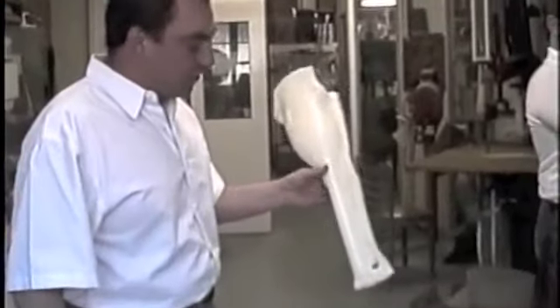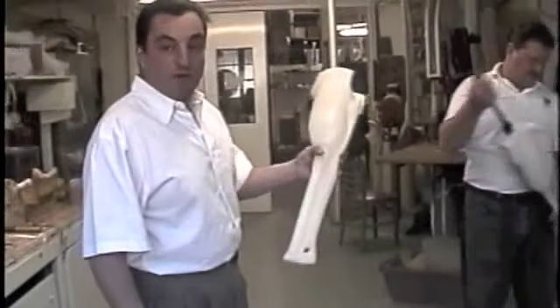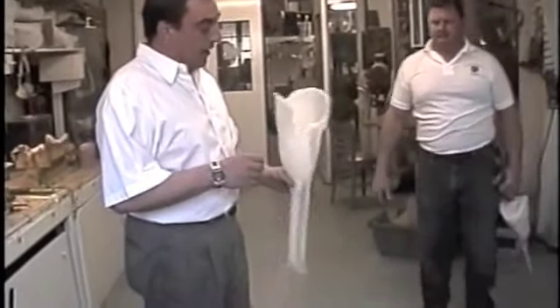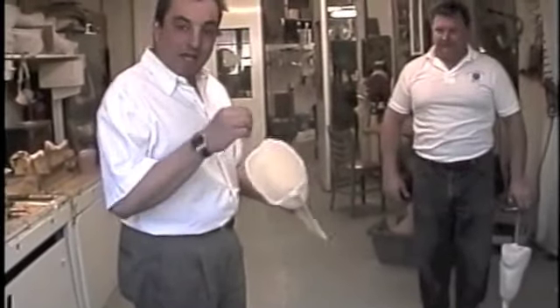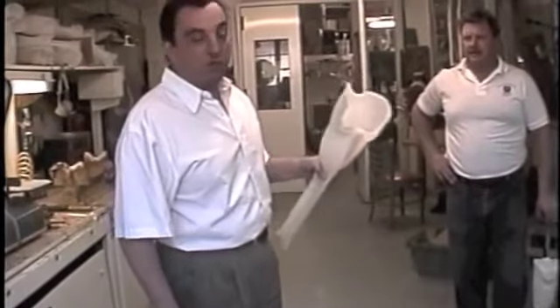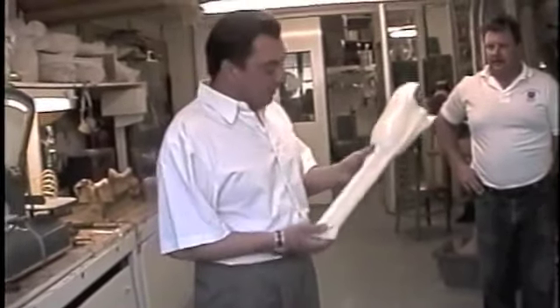Now this prosthesis was just molded about 15 or 20 minutes ago. It's okay to remove them the same day. There are a couple things that may happen. If you remove it the same day, your socket may shrink equivalent to about 1 ply. And if 1 ply is an issue, leave it on the model overnight and remove it the following day. If it's not an issue, you can take it off the same day.